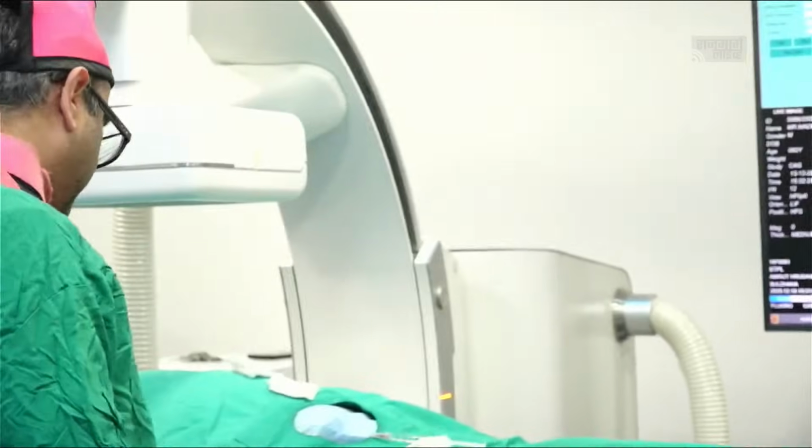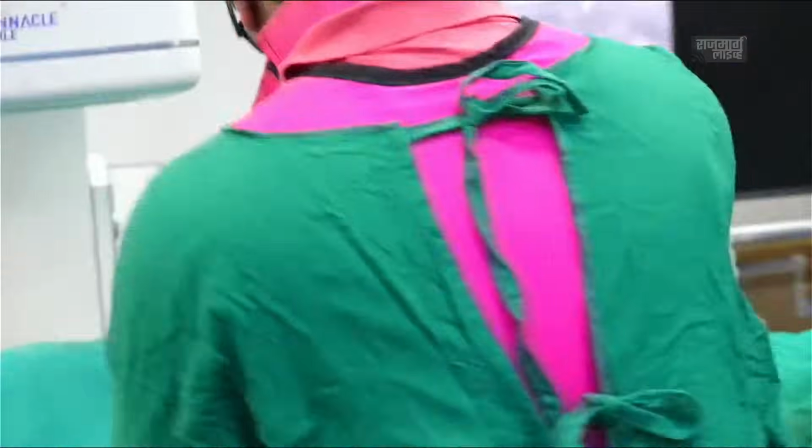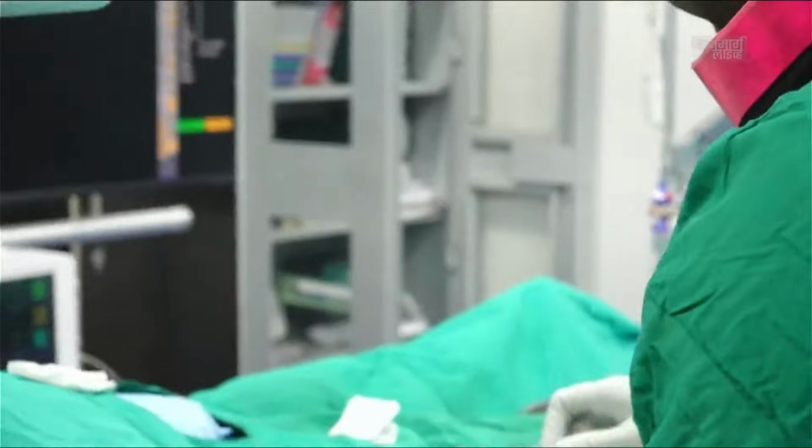First, we will take the radial artery puncture. We'll take the right radial artery, give local anesthesia, and then take an artery puncture.